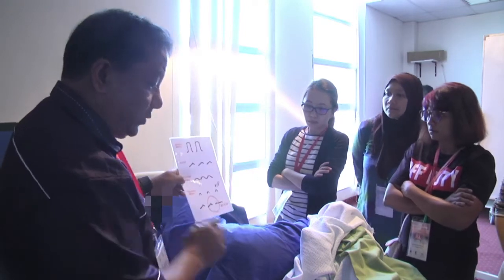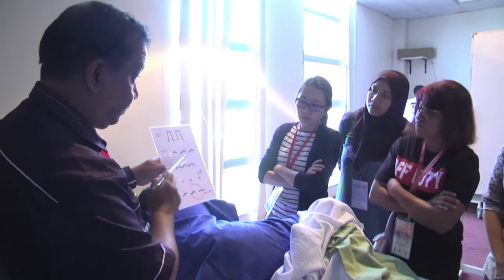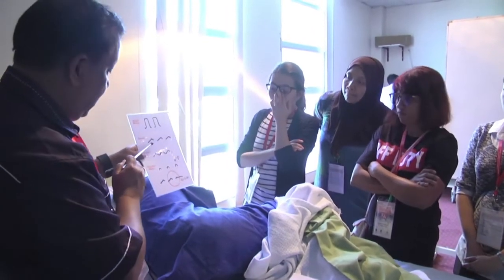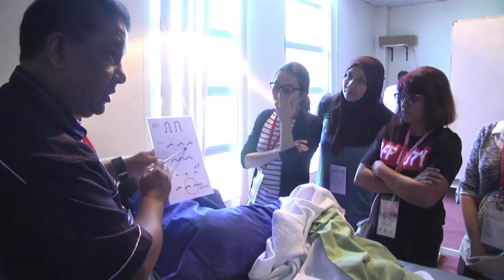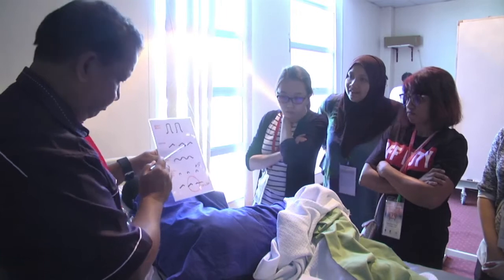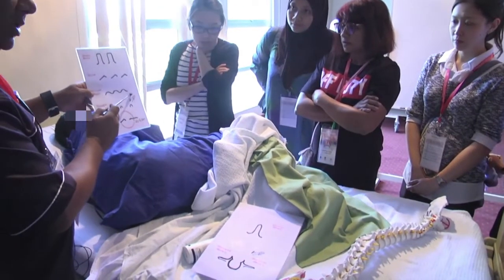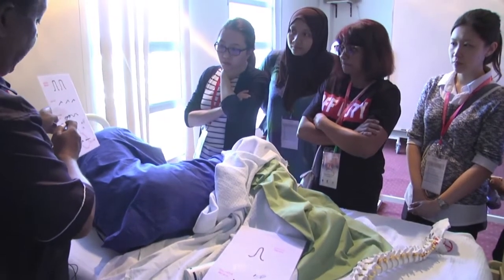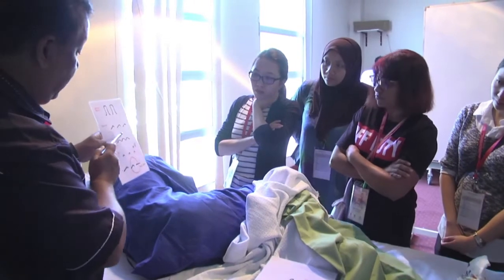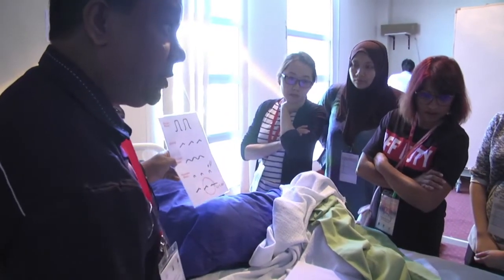So you can see here, as we go from medial to lateral, you'll see the lamina first, okay? It looks like the horse head, you know. Okay, these are the interlaminar spaces. So this is basically the stairway to heaven if you want to put the needle. And if you go further lateral, you will see the articular processes. They're different, see? There's no gaps here. And there's no anterior complex here, because the anterior complex would be here, right? And these are the transverse processes you see in the lateral aspect.